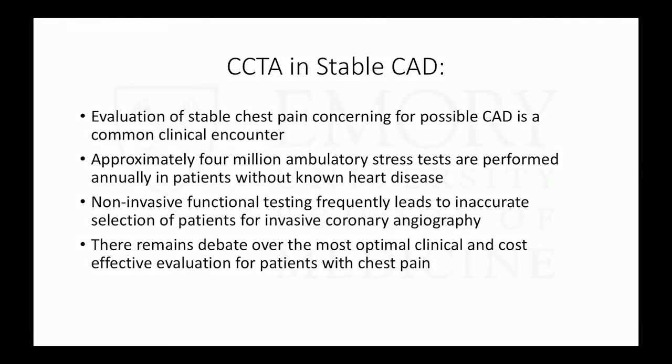So now I'm going to transition to moving beyond just discussions about sensitivity and specificity, and really examining the role that CCTA has had on clinical outcomes, first with stable CAD. Approximately 4 million stress tests each year are performed in patients that have no known history of coronary disease.